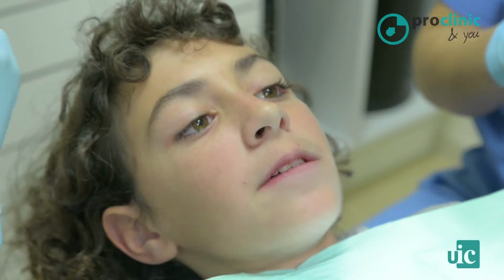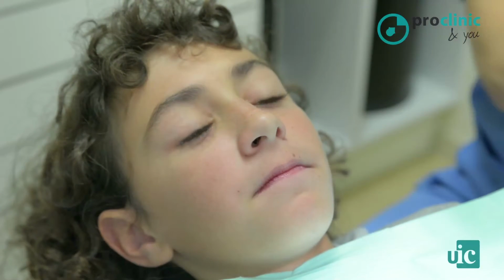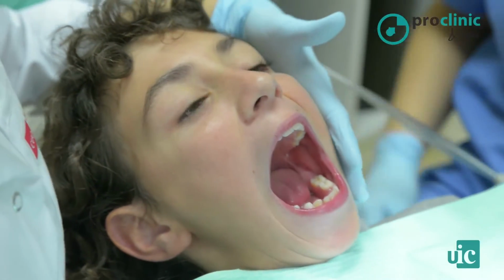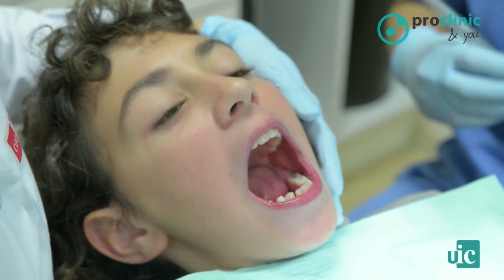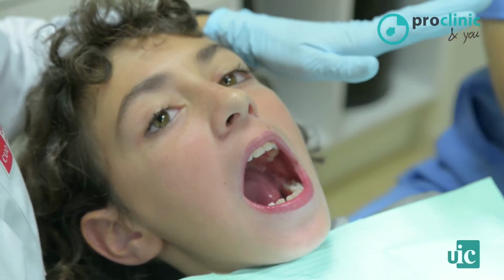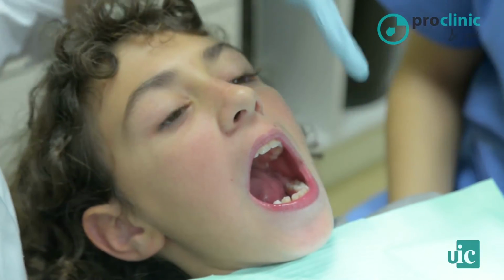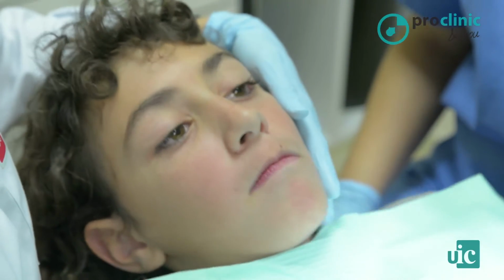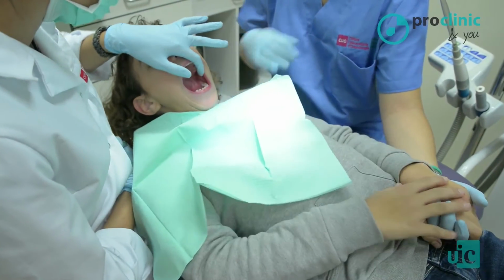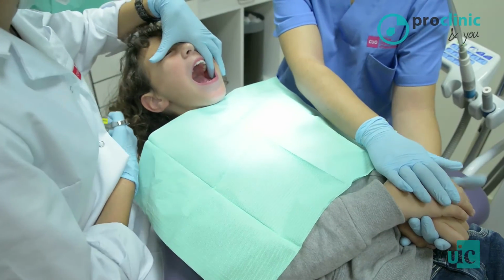Now we are going to inject the local anesthesia through an inferior alveolar nerve block. Now I'm going to place a sleepy solution, and you'll notice a tiny pinch like a mosquito bite, but it doesn't hurt. Don't be scared. You should not move at the time I am placing the liquid. If you want, you can hold Maria's hands, and if you notice it is very cold, you can squeeze her hands and she will tell me to stop. Open your mouth bigger and close your eyes strongly, because we don't want to splash you around.